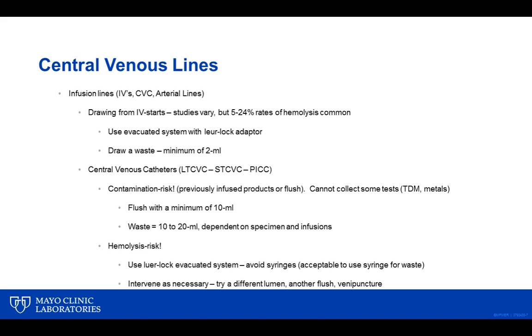However, here, the phlebotomist is responsible for not only identifying the patient, but retrieving the order, printing the labels. And they're also trained, we train our phlebotomists to know what they need to know from a line collection so that they can help the nurse, so they can intervene if they should see something that is being done incorrectly to make sure that we get a quality specimen.